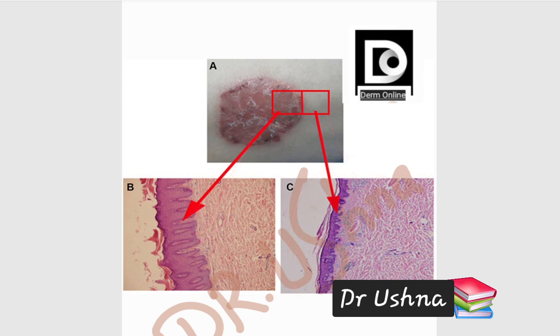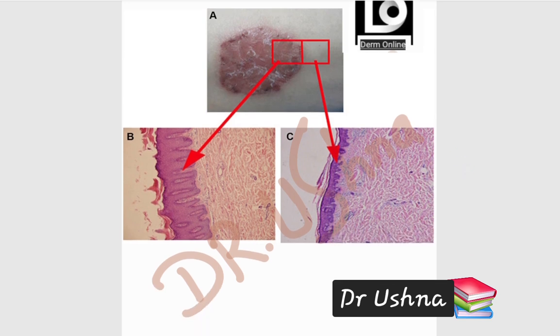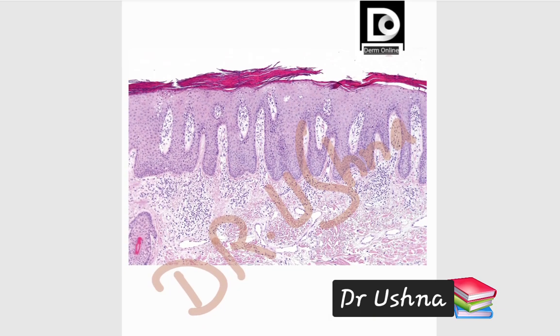If you are not aware of histology, you have zero knowledge about the histology, you are just a beginner, then by looking at two slides, you can make the differences that something is wrong here, and that is not comparable with the normal slide. You can see very large structures here which are not present in the normal skin. So we are able to identify something is wrong in our lesion portion. Okay, what is wrong? You have to look into the detail of that portion. This is a detailed slide of the histological portion of psoriasis, which exactly comes in your exam.